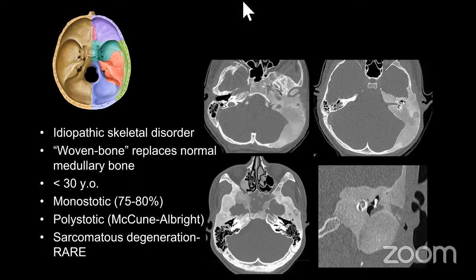And you'll say, is this a chordoma? Is it a metastasis? And so on and so forth. And what tips you off? Again, this is where MR can be helpful. Because if you perform your MR and you see something like this, and you've seen enough, what this is, is arrested pneumatization or incomplete pneumatization of the sphenoid sinus.